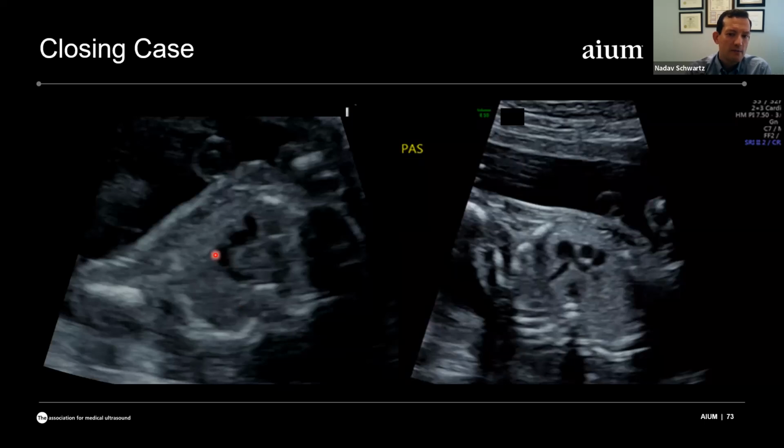We have the ductal arch here and the pulmonary artery over here. The aorta may be similar in size, but maybe slightly smaller, nothing alarming, but then the SVC does seem large. In fact, in this view, where we see the branch pulmonary arteries coming off the pulmonary, the pulmonary is bigger than the aorta, but the SVC is larger than the aorta. So I would say that this view made us suspicious that something's going on because this SVC is too big.